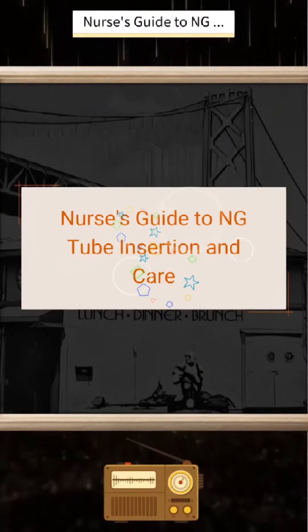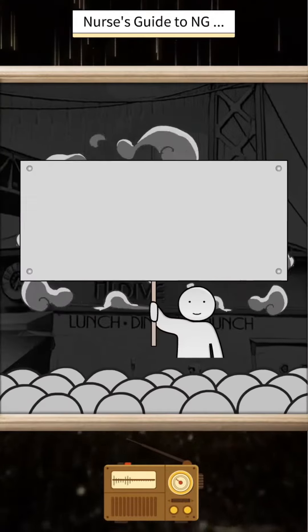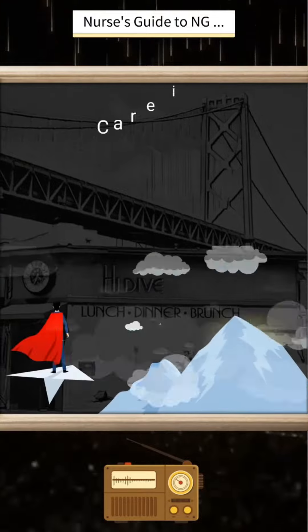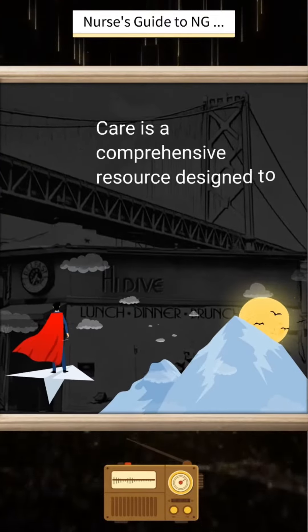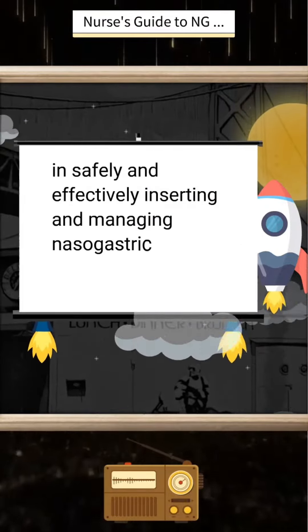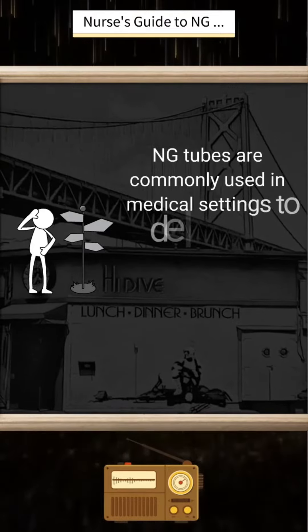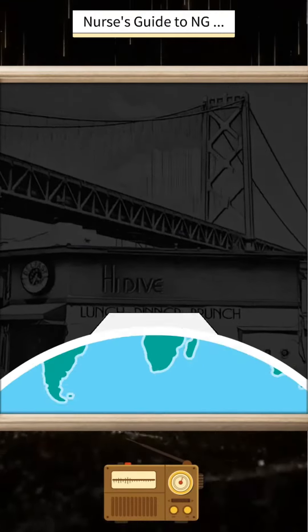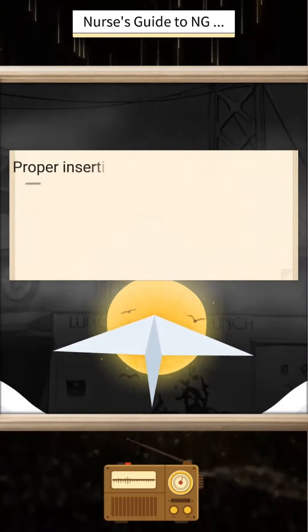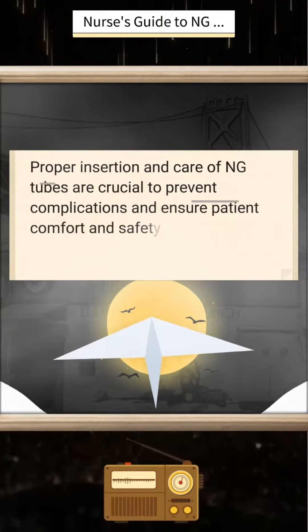The Nurses Guide to NG, Nasogastric, Tube Insertion and Care is a comprehensive resource designed to assist nurses in safely and effectively inserting and managing nasogastric tubes in patients. NG tubes are commonly used in medical settings to deliver nutrition, medication, or to remove excess fluids from the stomach. Proper insertion and care of NG tubes are crucial to prevent complications and ensure patient comfort and safety.